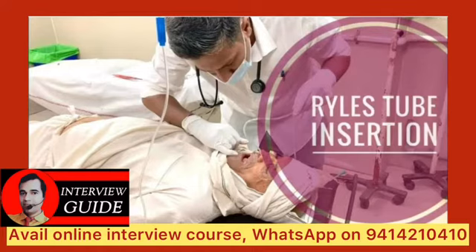Now procedure. At first we have to explain the procedure to the patient, and in case of an unconscious patient, to the patient's relatives. Then we have to take consent. For inserting the Ryles tube, we have to keep the head of the patient in semi-upright position.